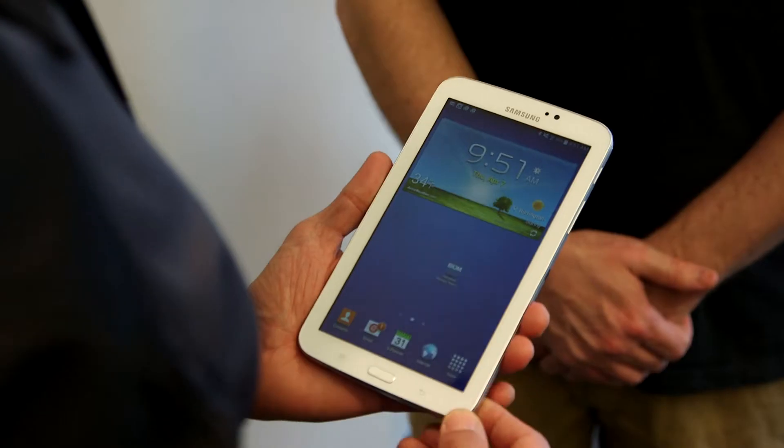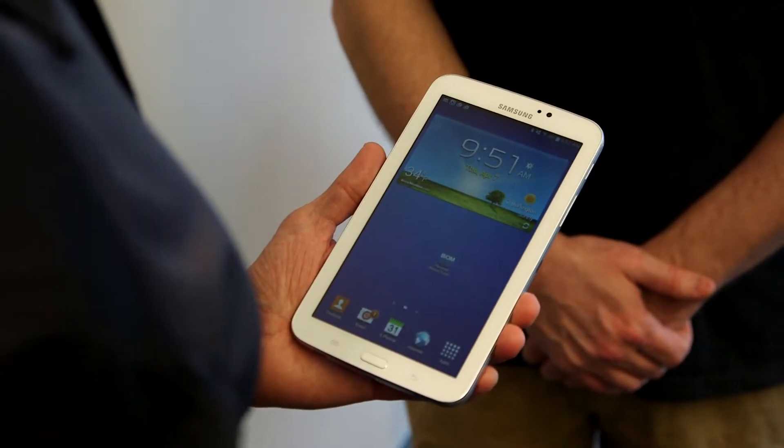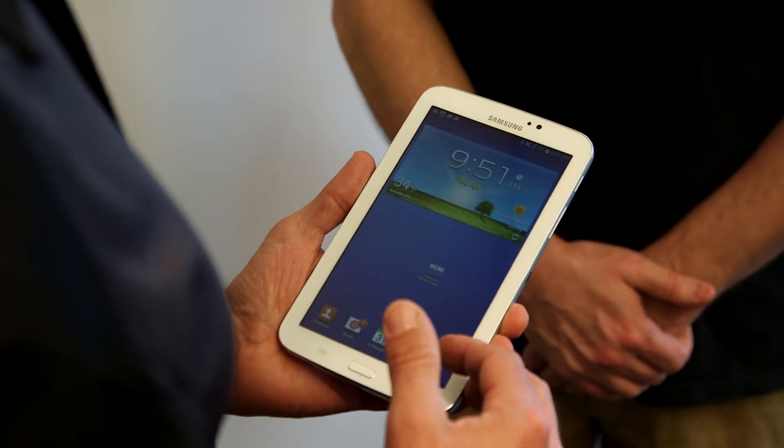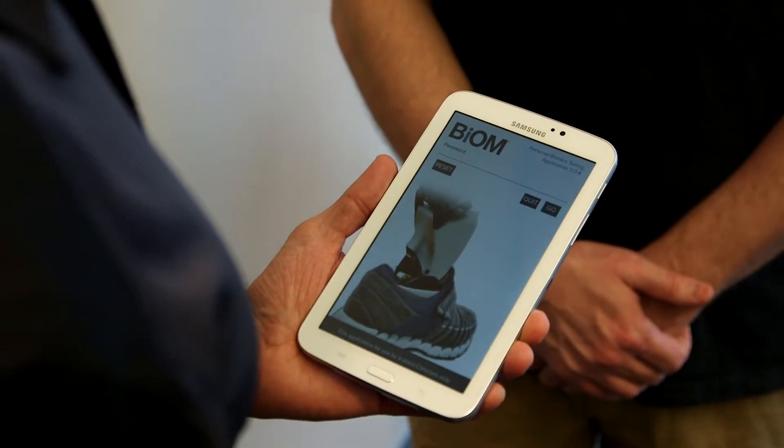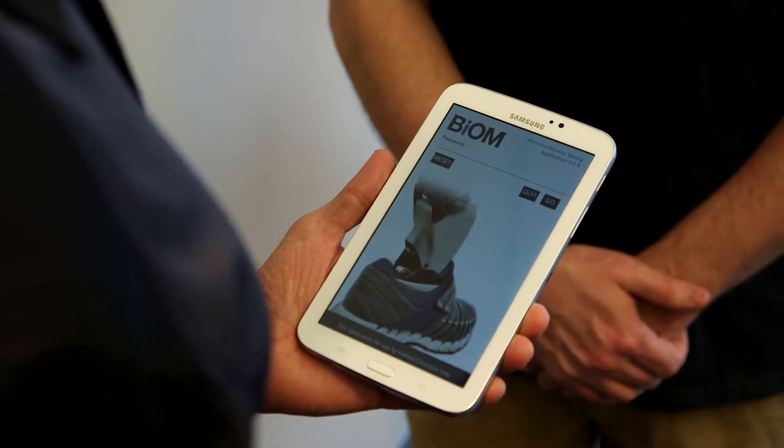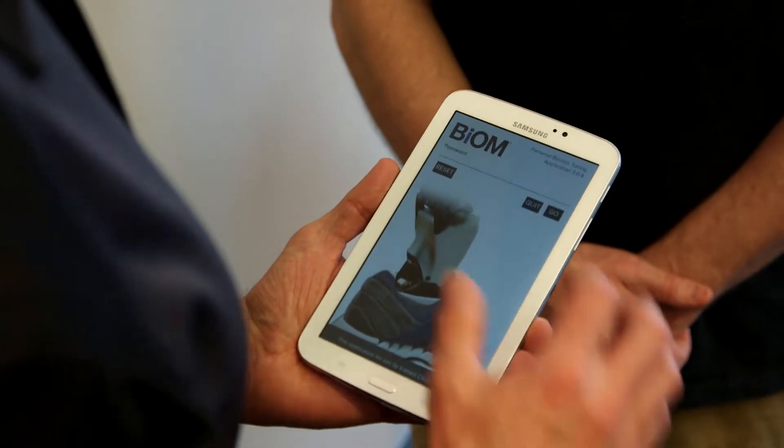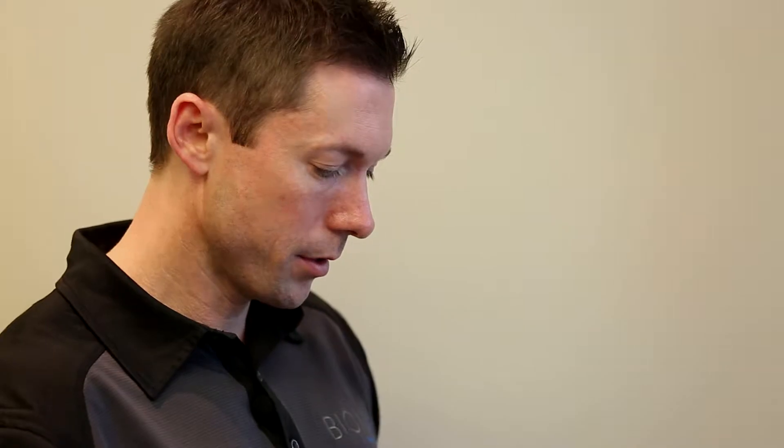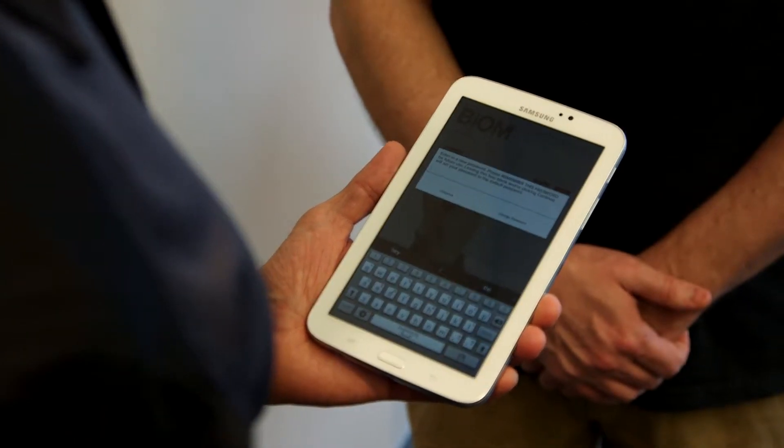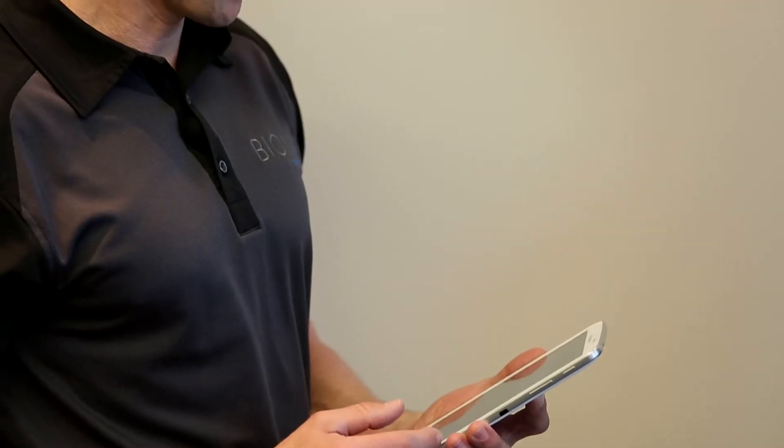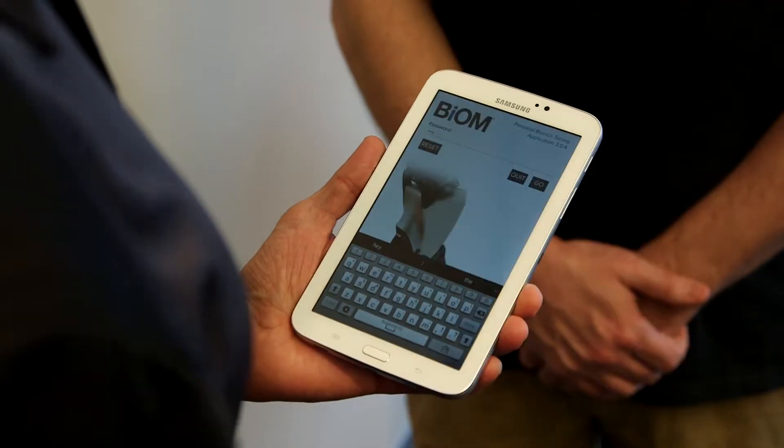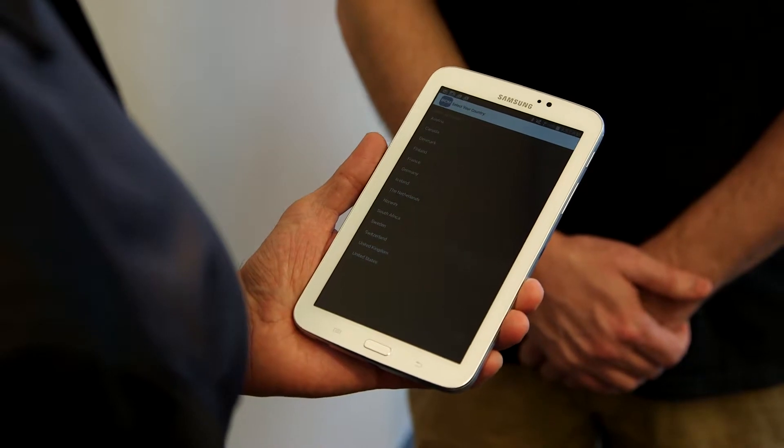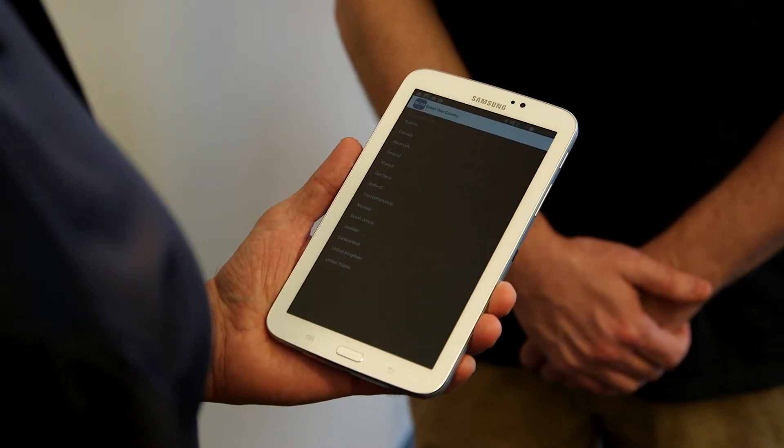With the purchase of a new ankle, each customer receives a tablet as part of the purchase. It's a Samsung Galaxy tablet, and they're going to have the Biome app pre-installed onto that tablet. They go to their home page, they'll see the blue Biome app, and it's as simple as touching on the app, which will open up a login screen. At that point, it's going to ask for the password. There is a default password of 1234. They just touch underneath the password, which will bring up the keyboard, and they'll punch in 1234, hit go.